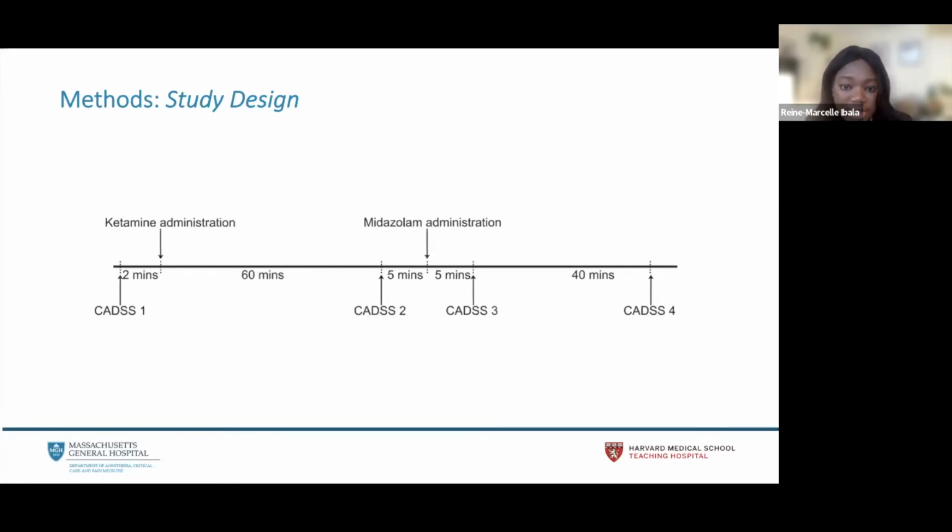And being able to see this model helps us define our data based off of 5 different timestamps. Just want to clarify that for us, ketamine unresponsive meant the point in time where participants stopped clicking their device, so they became unresponsive. We don't want to necessarily associate this with unconsciousness, as we weren't able to prove unconsciousness, but this would be more of a sedated state. Meanwhile, ketamine responsiveness refers to patients once they were able to emerge from the ketamine sedation and were able to speak to the clinicians and conduct a CADS assessment, but they were still in an altered state, which we associate with dissociation.